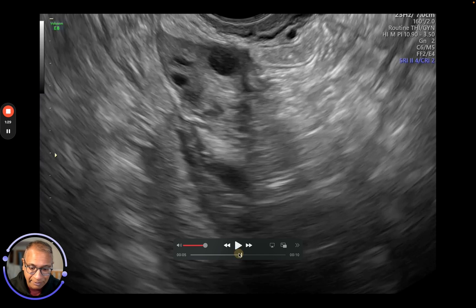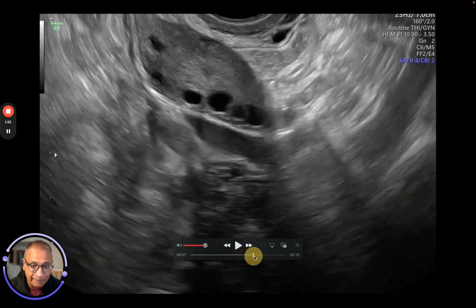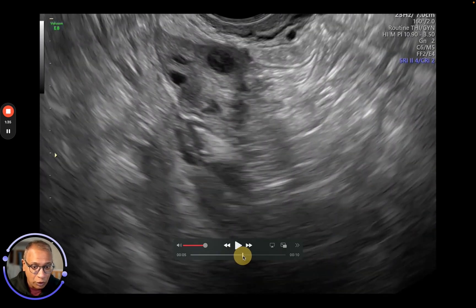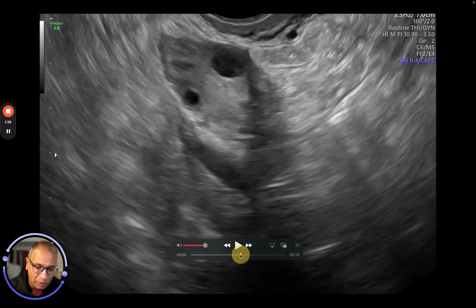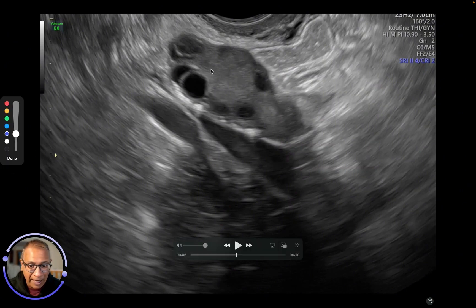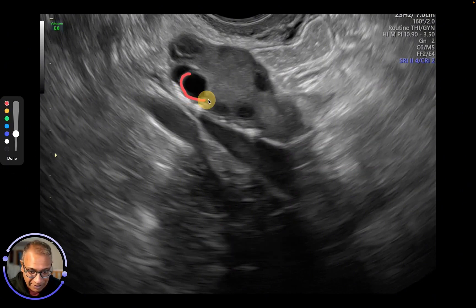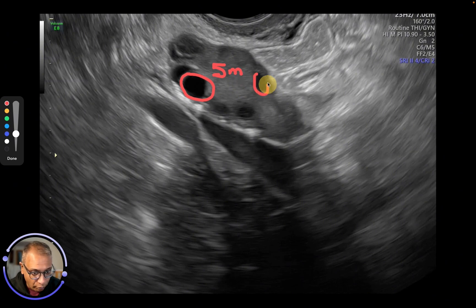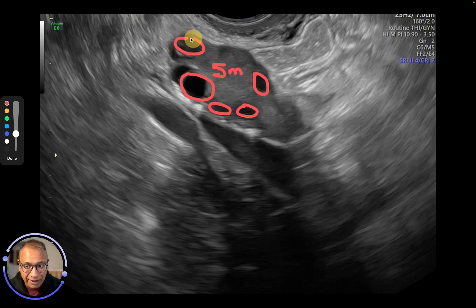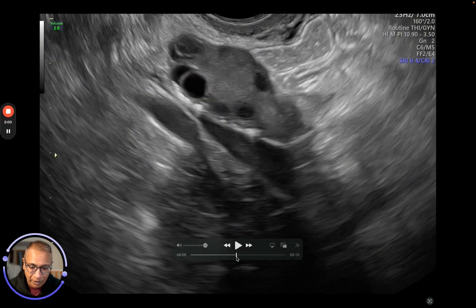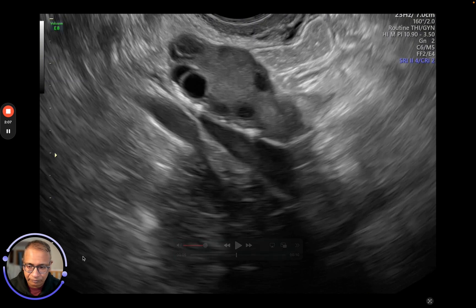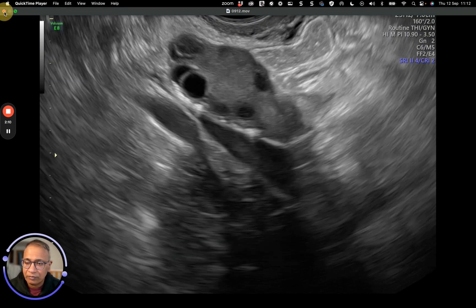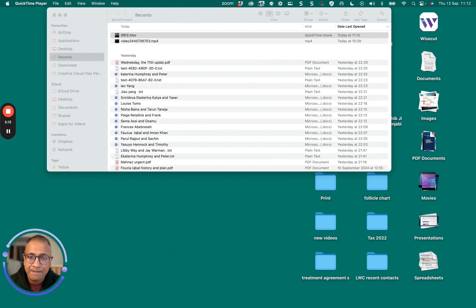This ovary has a much better antral follicle count than we had seen before. Whenever you go in for a scan, what is important is the size of the follicle and the number. If you can measure follicles of five millimeters or more — or even four millimeters — counting how many there are gives you your antral follicle count. The more you have, the better the possibility of getting more eggs.